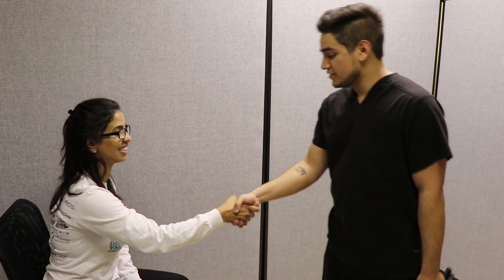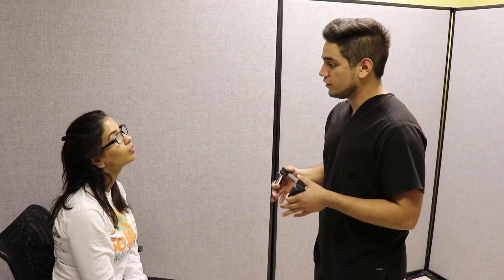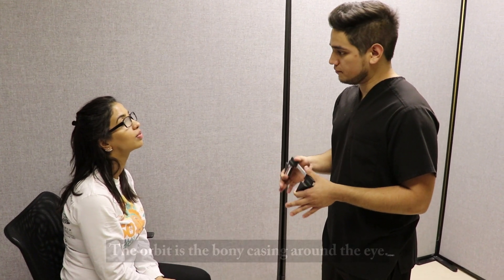Hello, Ms. Smith or Richard? Hi. Today we're going to be doing the Hertel test, which measures how far the eyes set outside the bone encasing of the face, called the orbit. This is the measure of any progression in thyroid eye disease or any other issues with the orbit.